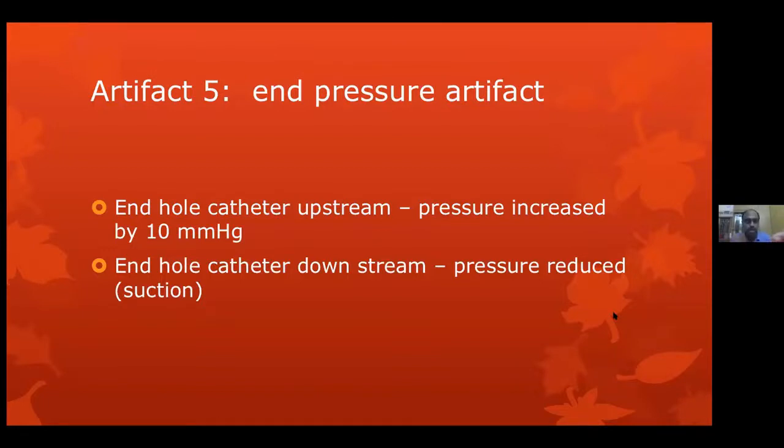Let us assume I have given an input frequency of 10 megahertz. I cannot actually create 10 megahertz as audible sound, since audible sound is less than 20,000 hertz, but let us assume it. If the object is coming towards me, the 10 megahertz will become 11 megahertz. If the object is going away from me, the 10 megahertz will become 9 megahertz. This frequency shift is the Doppler principle.